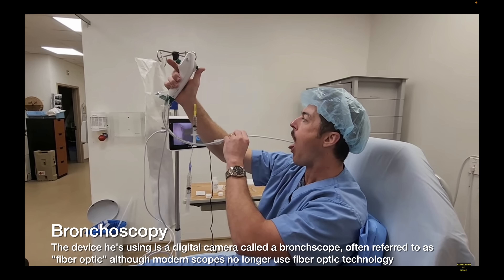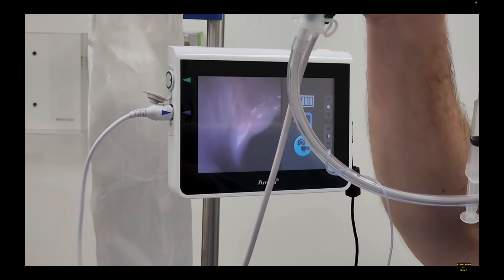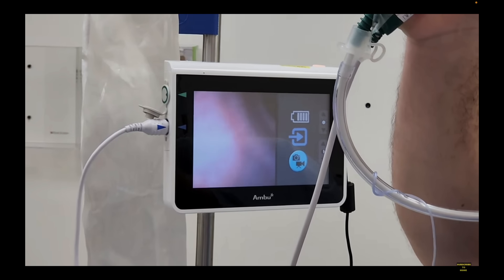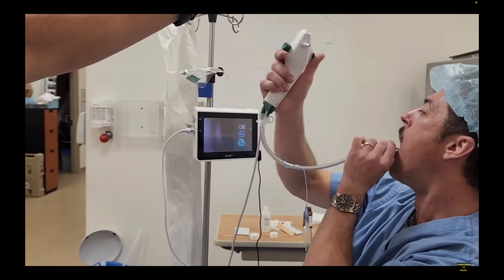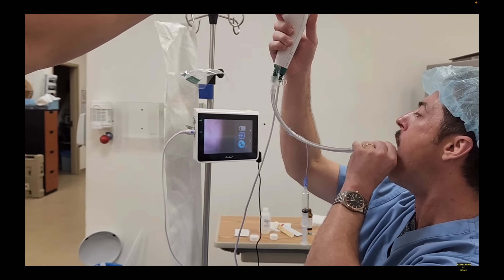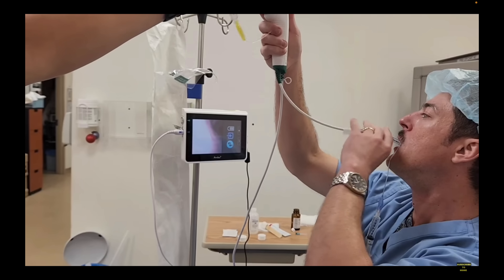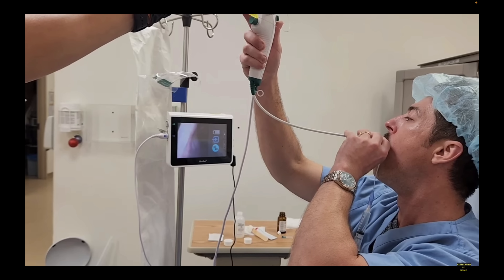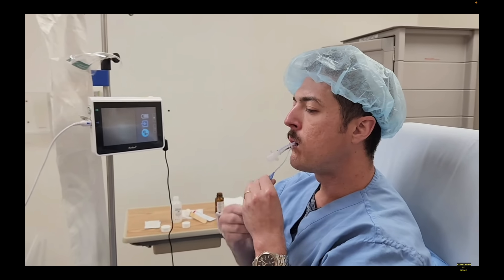Now he's going to get started intubating himself. Ordinarily anesthesiologists are intubating a patient, so it takes some extra skill to do this. You can see on the screen that he is expertly navigating the anatomy, finding the way to the vocal cords. He's actually already into the windpipe, which is called the trachea. What you're looking at on the screen are the tracheal rings. Now he's got the scope all the way down to where the windpipe splits off into both lungs — these are called the main stem bronchi. He's happy with where he is, so he's sliding off the endotracheal tube, or breathing tube, that's already loaded onto the fiber optic scope. He'll advance this tube far enough that he can see the tip of the tube as it reaches where the lungs split off. Now he takes out the scope and he is breathing through this tube — a testament to how well he applied the lidocaine, he actually appears pretty comfortable.